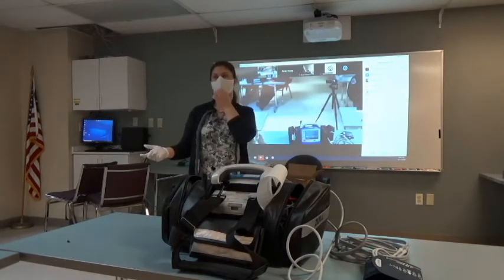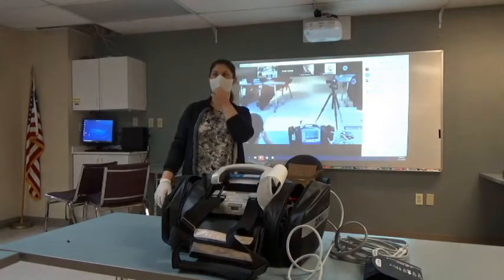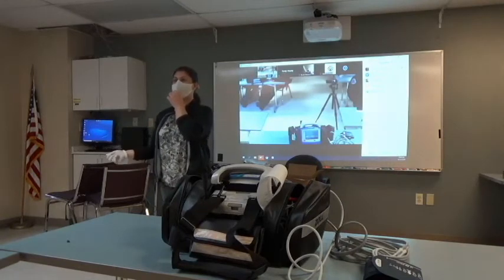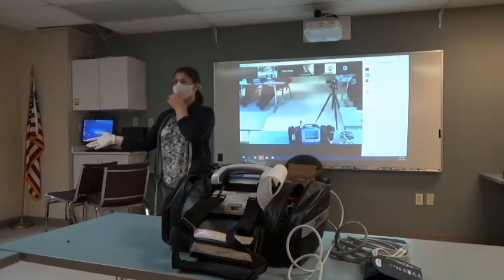So again, if I press the button right now, it's going to beep at me, but I hit the button push and then I attach it to my patient. So device, connection, button push, patient. What would happen if we don't do it in that order?